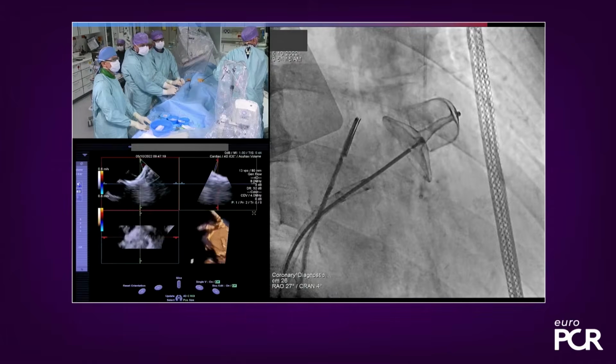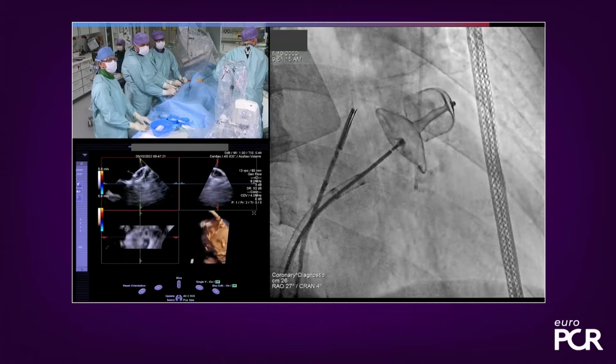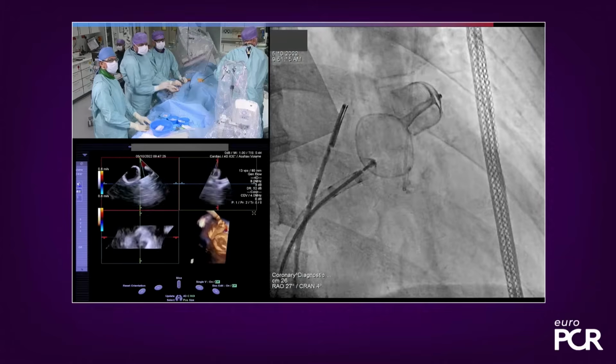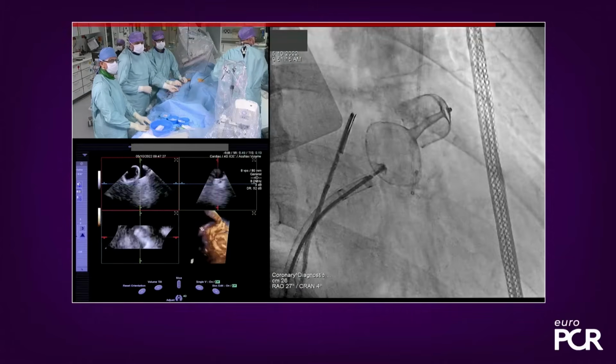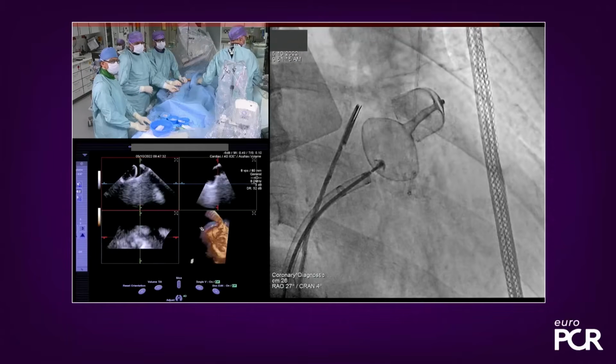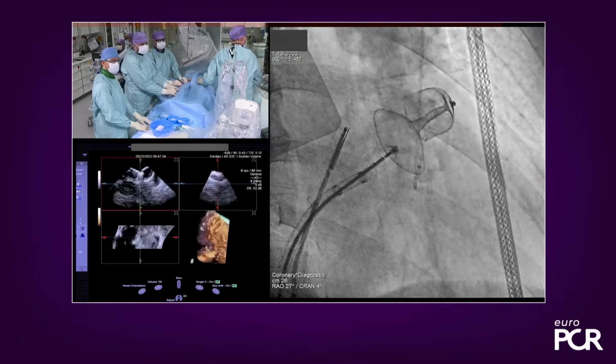Well, we can do a tug test. So I pull back on the cable, bring the disc a little bit away. We can keep it here for a few seconds and see where the cup is in a stable position. Yeah, so this is a good tug test indeed, and then I think this is indeed sufficient. Push it a little bit back again.